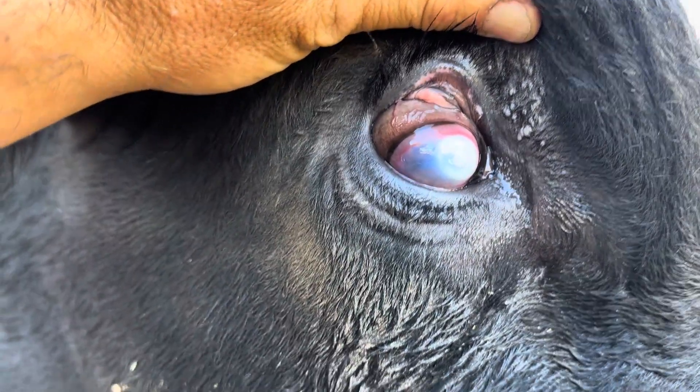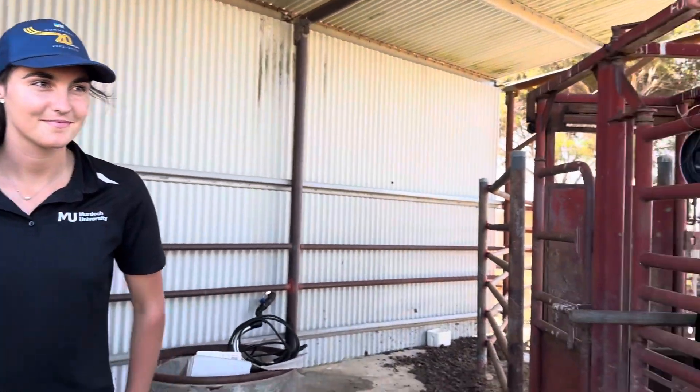So what we're going to do is inject a little bit of subconjunctival penicillin mixed with Dex. I'll turn around and see how we do it, guys. What do you reckon? Excited?